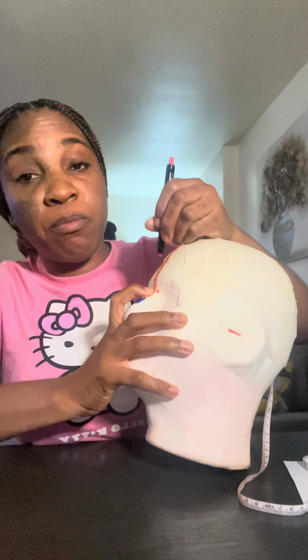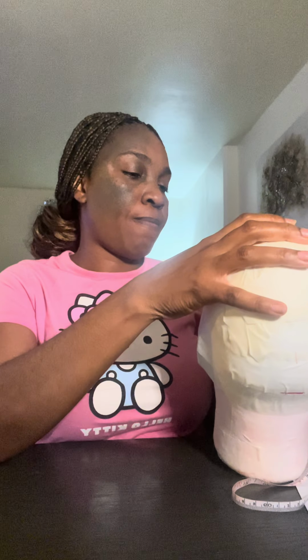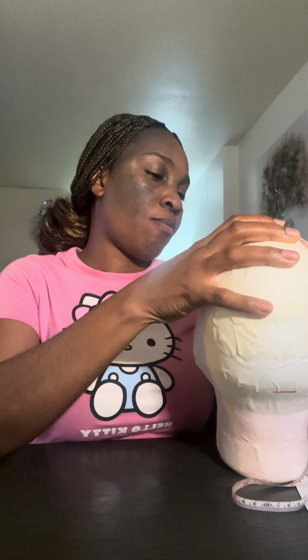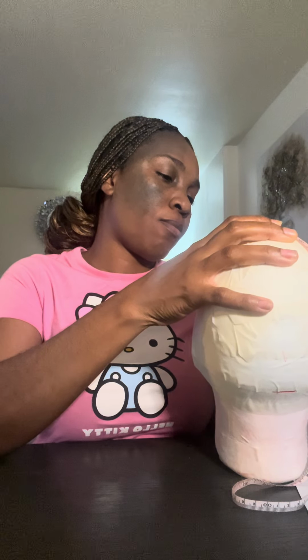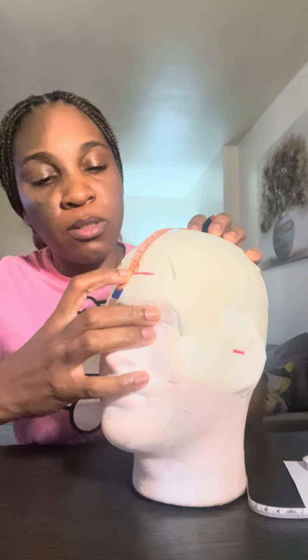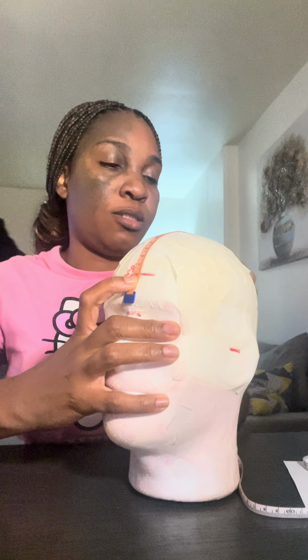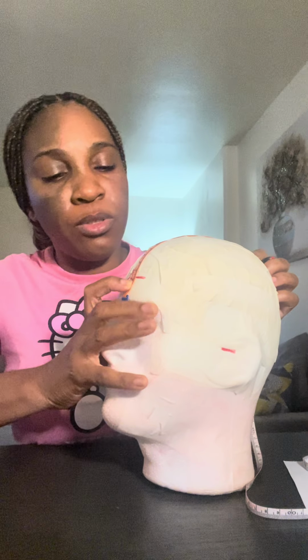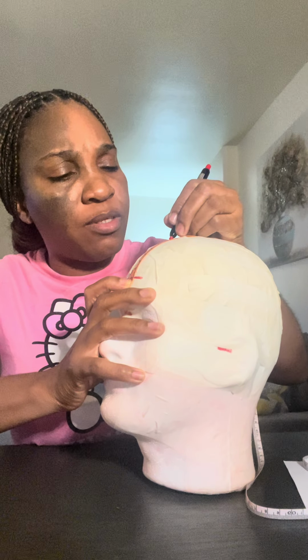This is going to give me my FPZ. Putting my tape on the 0 mark on FPZ, going back 20%. This is going to be 7, and this is my FZ.